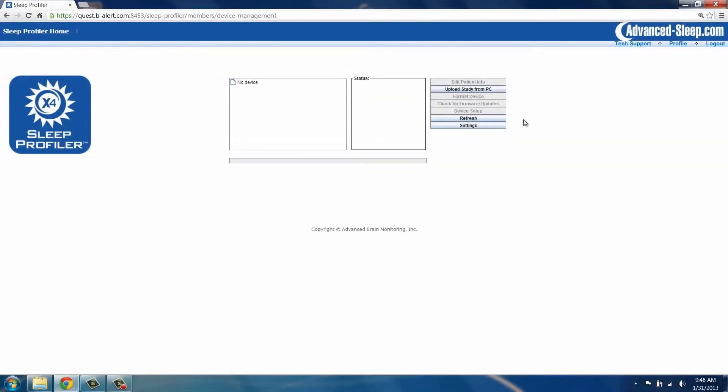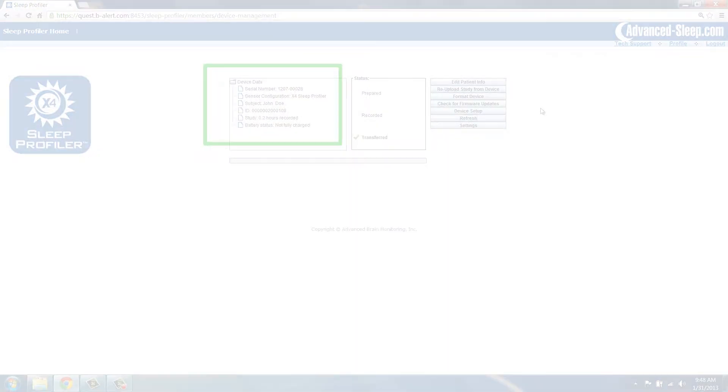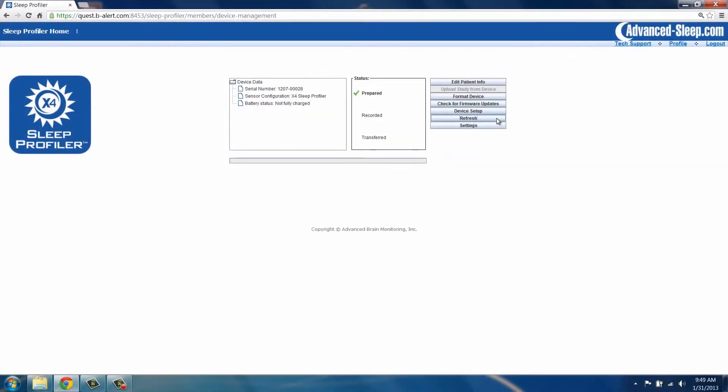Click the Refresh button. The device serial number will appear under Device Data. To initiate a study, the device status must be prepared.